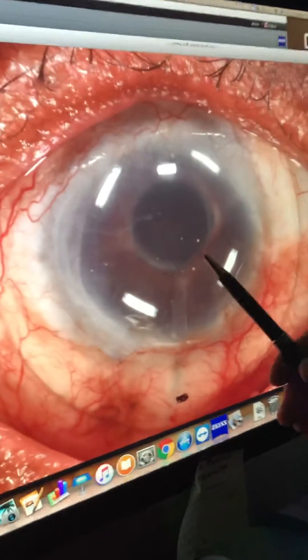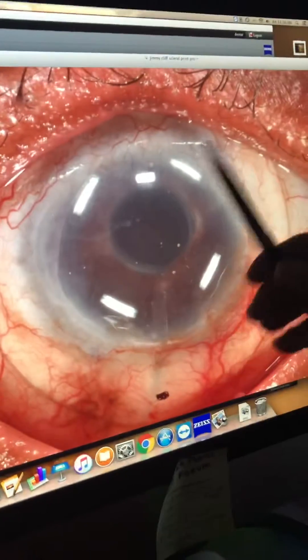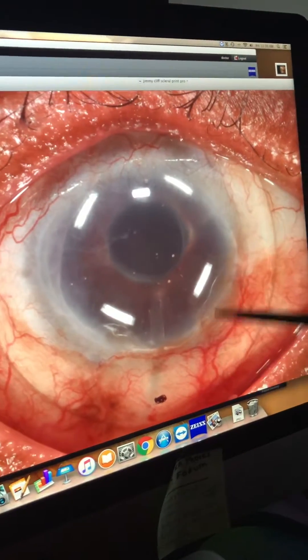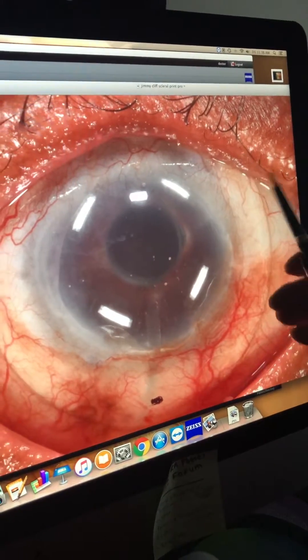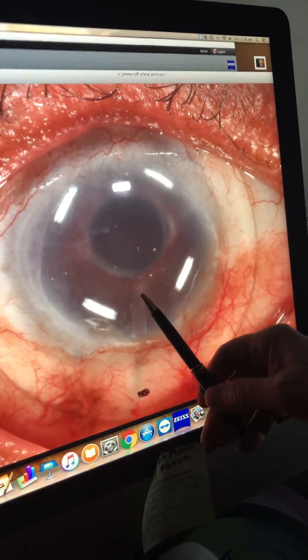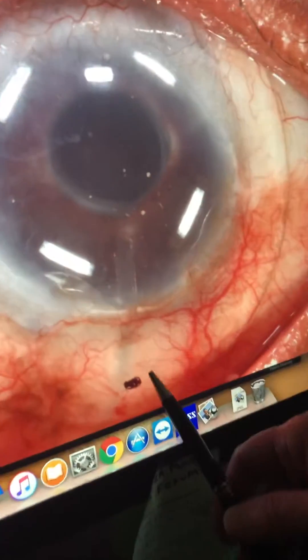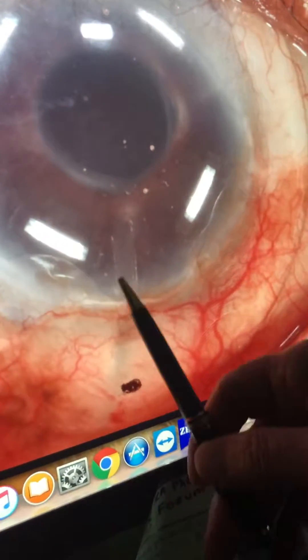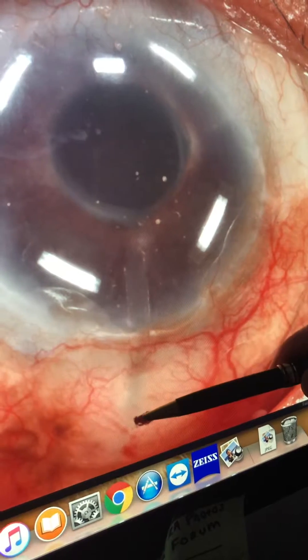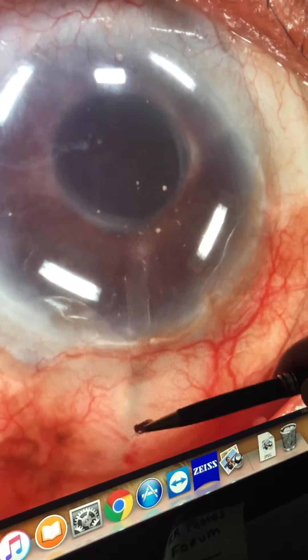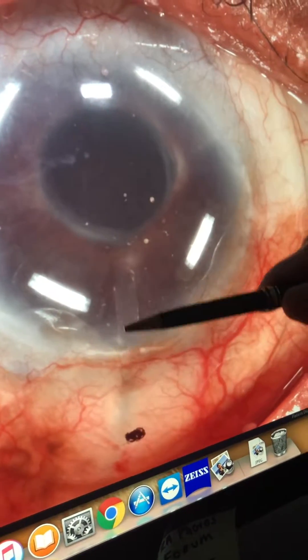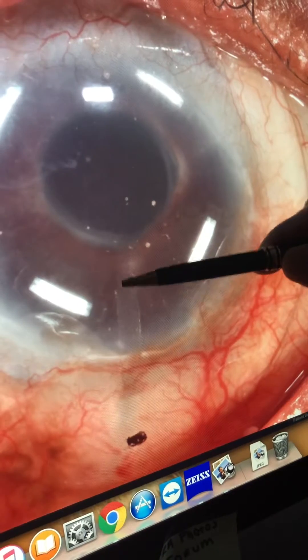Over here, this is the right eye of a patient that underwent four separate surgeries and the front surface of the eye is extremely distorted. The last surgery this patient had was a glaucoma shunt that was implanted, and you can see right here the shunt from underneath the right of the eye, from the sclera going into the anterior chamber.